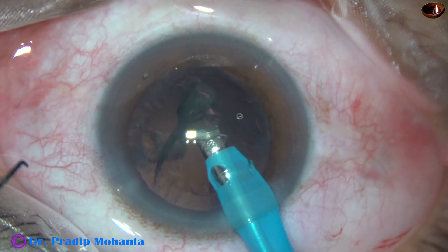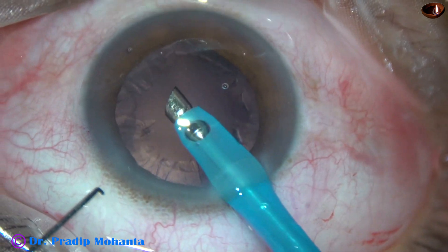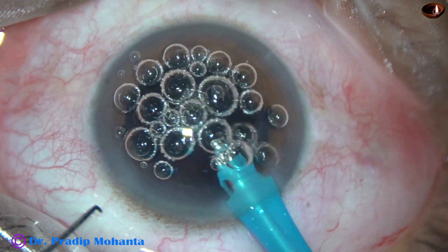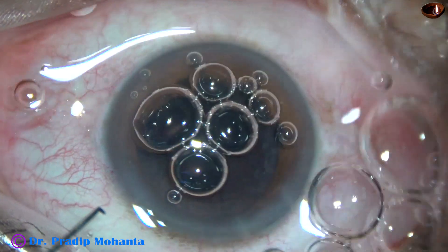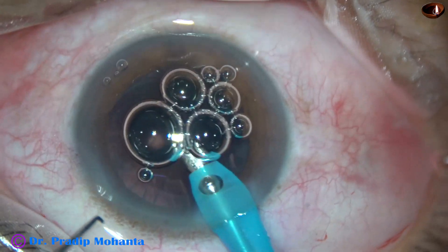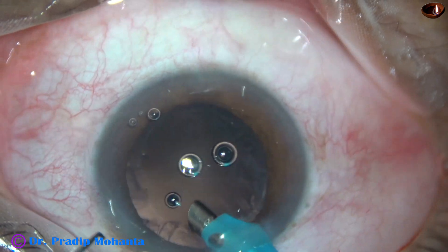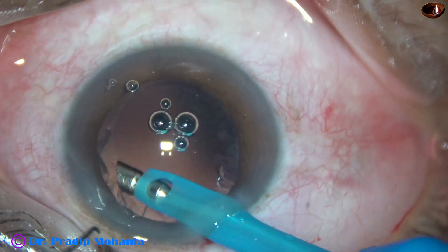At this time I ask my assistants to reduce the parameters. And now I am going to try to remove the cortex by the handpiece itself. But at this time a lot of air bubbles came from the bottle — remove the air bubble. Again I try to remove the cortex by the handpiece itself.